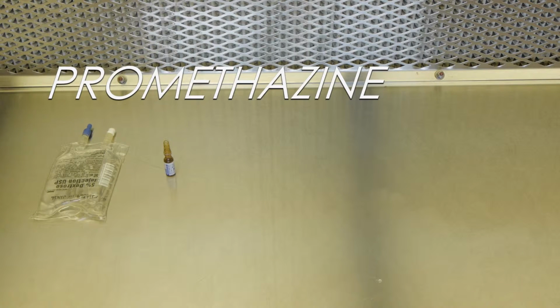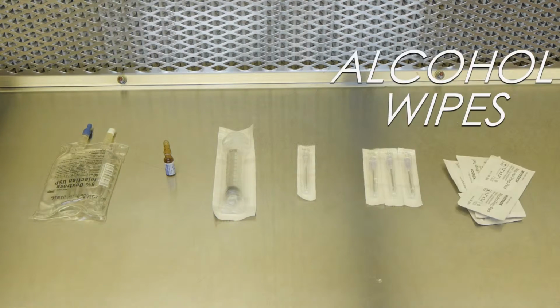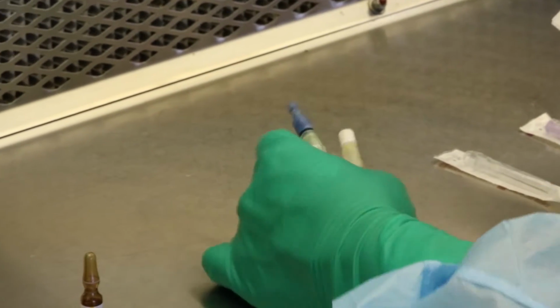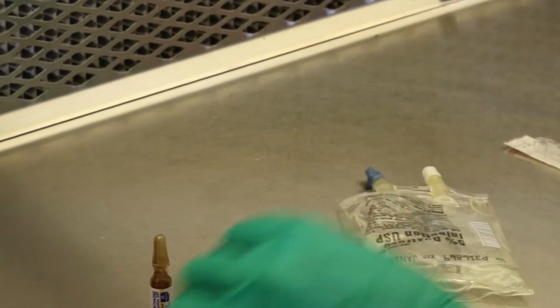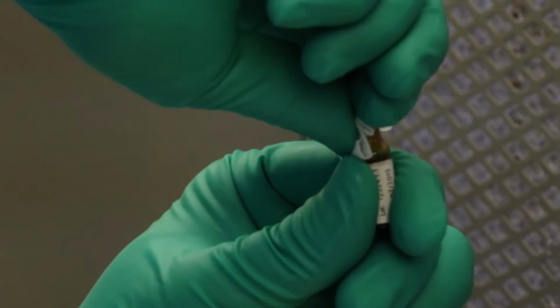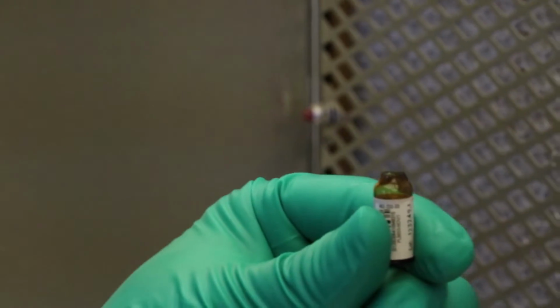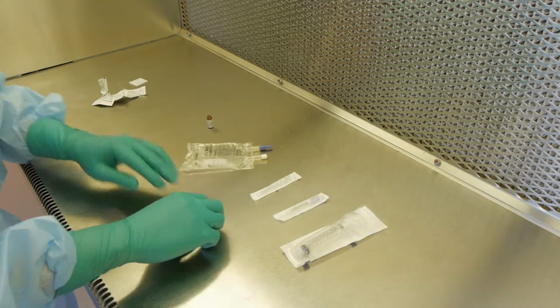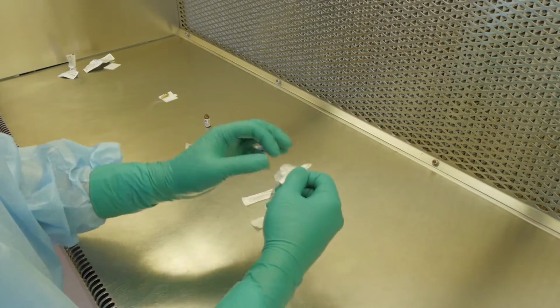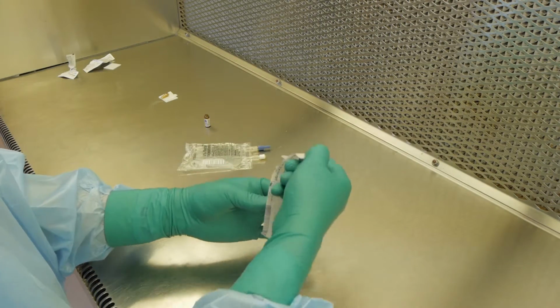Lastly, you will learn how to work with ampules. You will need the following. As before, wipe off all the ports with alcohol swabs. Holding the ampule up, put pressure on the neck of the ampule, facing the force away from you, and break the top off. Now withdraw the contents of your ampule into your syringe.